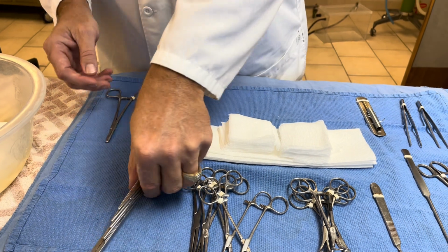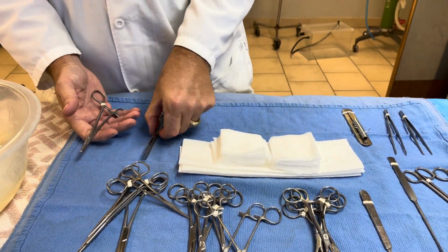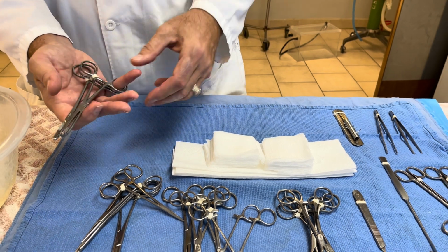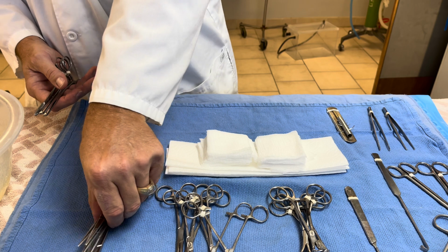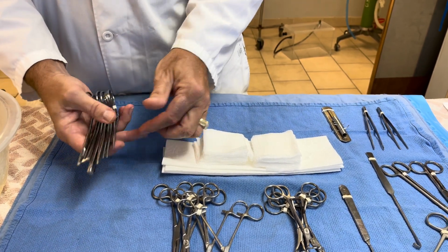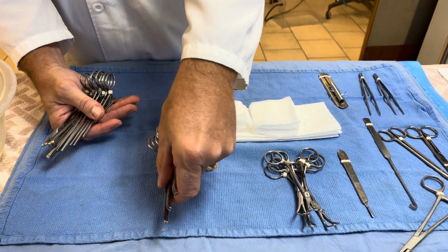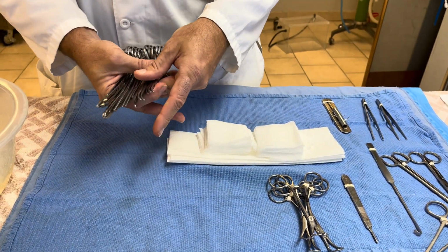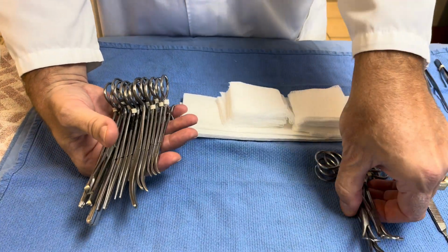Actually, you're not going to start with those. You're going to start with your needle driver, okay? Then you're going to put your Alice tissue forceps, and see how I'm putting them on my finger? You don't have to use your pinky, but you use a finger, and you'll see why. And then you put your flat forceps, see how that keeps them all nice together. And you usually do them in ascending order, so smallest to largest. Okay, see now, you see how that looks? Smallest to largest of each kind.